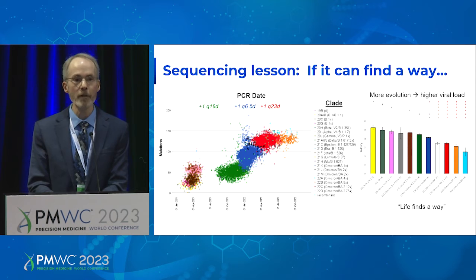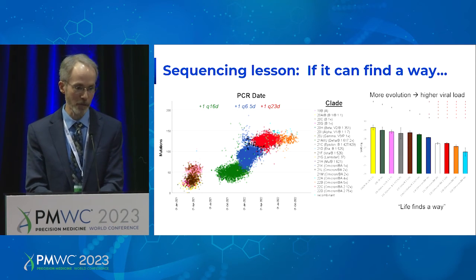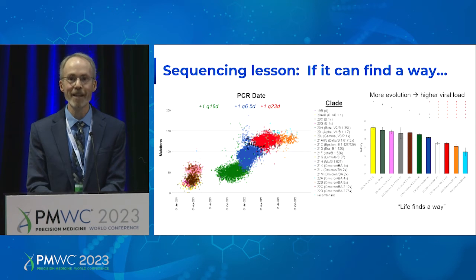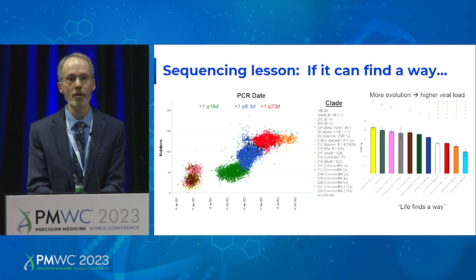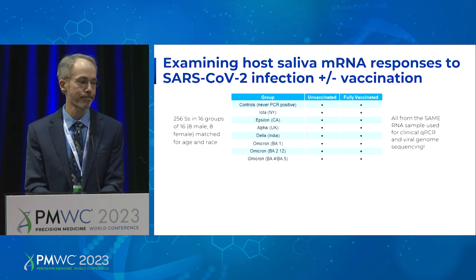In fact, one of the things that this virus has obviously done, in addition to increasing its virulence, is increasing the load. Using exactly the same qPCR methods across time, we can now share with you that as this virus has mutated, we're detecting higher and higher levels. So lower CT values in the PCR test are necessary across time. This is perfectly adapting to us.